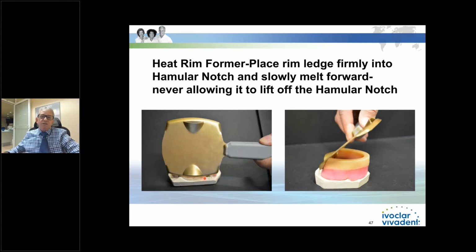And all we have to do is heat this spatula up. Instead of using the big boy, we're just going to heat up this spatula. I have one that's a two-sided one that's in the picture there. That's for a left-handed or a right-handed person. This is a right-handed. I've had this one for 30 years. Still in good shape. And all we're going to do is heat it. And we have our occlusal rim totally longer, of course. We put the measurement that you gave us, and we made a mark on our wax.